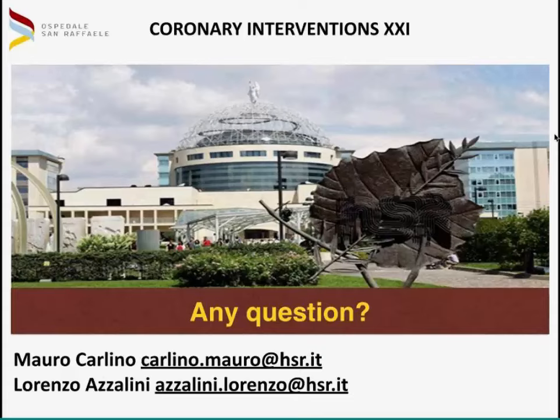Perfect. That's very useful. And then, people are debating how often you need to reverse CART versus go to the true retrograde to do true lumen to true lumen. Just in your experience, how often do you get to do true lumen by yourself, and how often do you have to do other things to go retrograde? More or less, I think in 20-25% I reach true to true lumen, and in the majority of cases I perform the reverse CART. This is my experience.